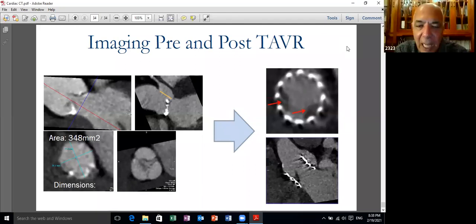What I'm saying is that if we are beyond 50%, meaning from 50 to 70 to 99, these patients should be investigated more. The traditional method is to go to non-invasive functional testing between 50 and 70, and go to functional testing or invasive angiography from 70 to 99, unless the patient has this lesion in the left main or three-vessel disease, so you go directly to invasive angiography. So you cannot tell a patient with 60% to just go home.